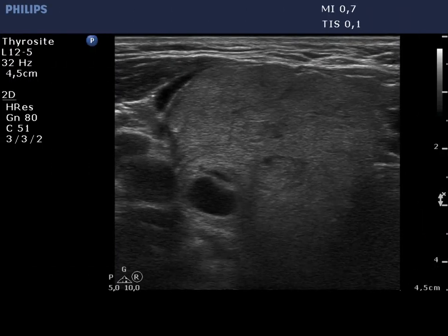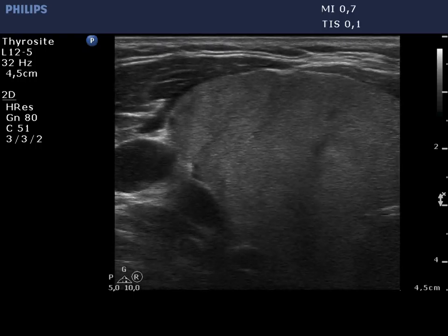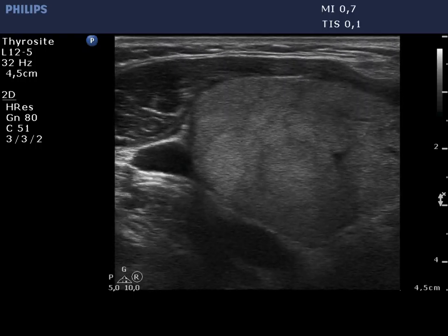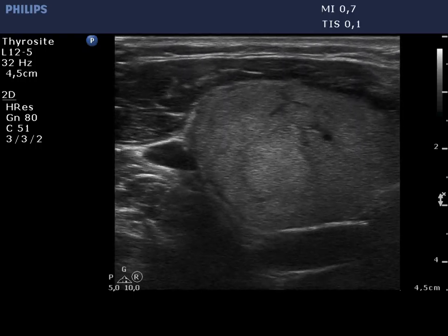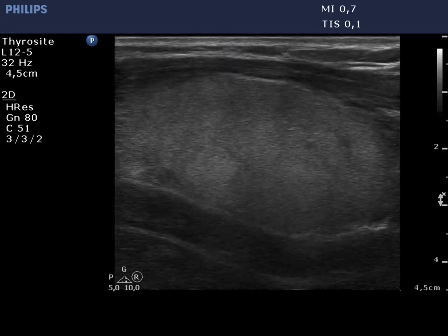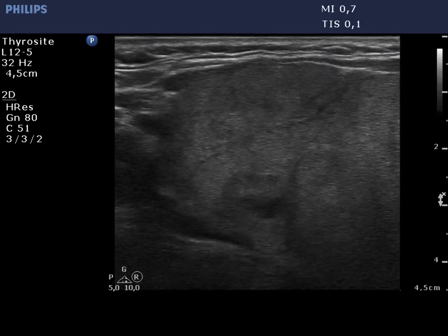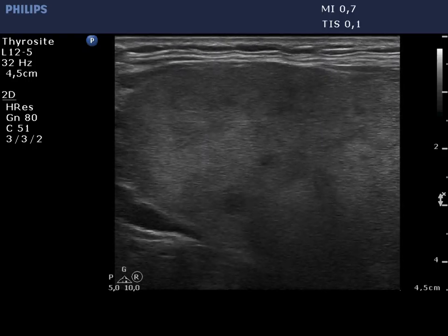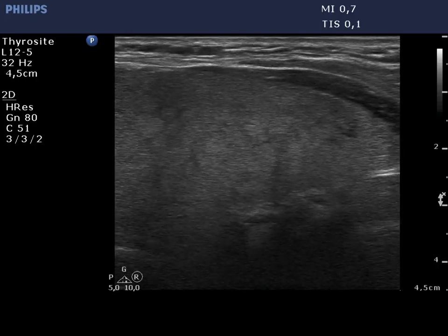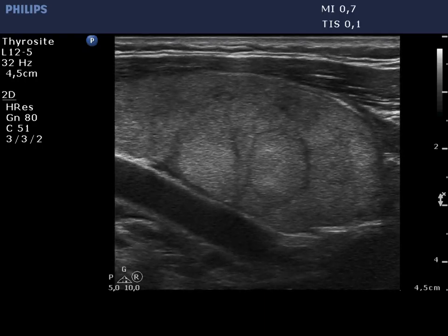The enlarged thyroid displays an echonormal, minimally hypoechoic basic echo pattern. The lobe is divided into smaller areas, none of which carries oncological significance. This is a typical micronodular or pseudolobular pattern.